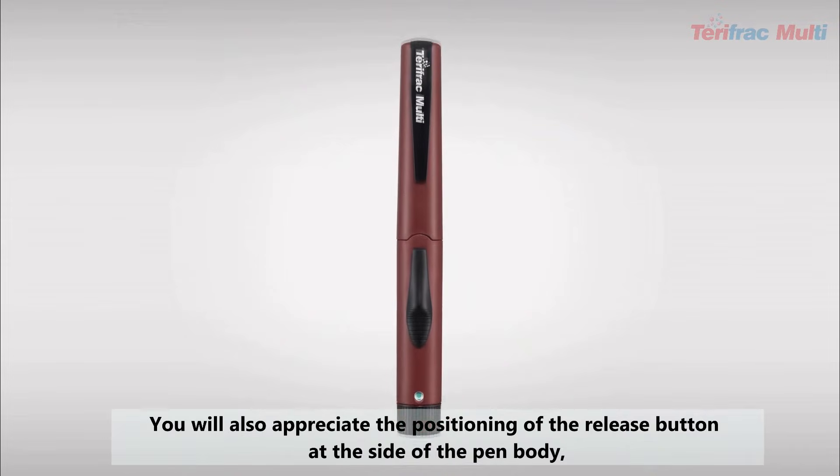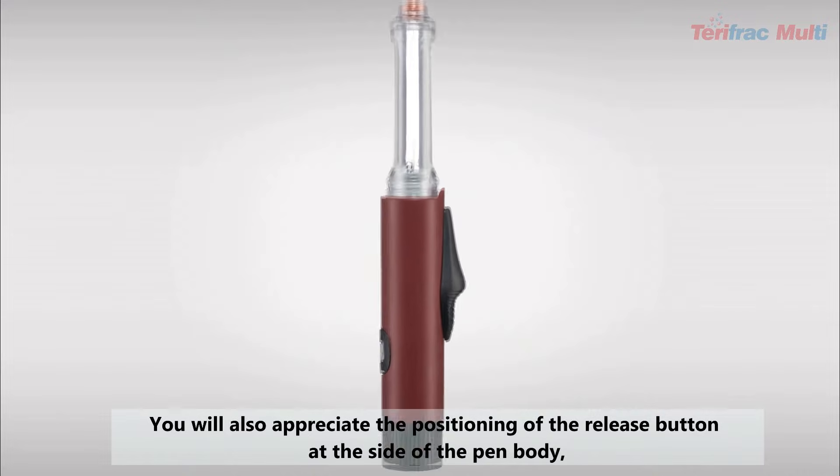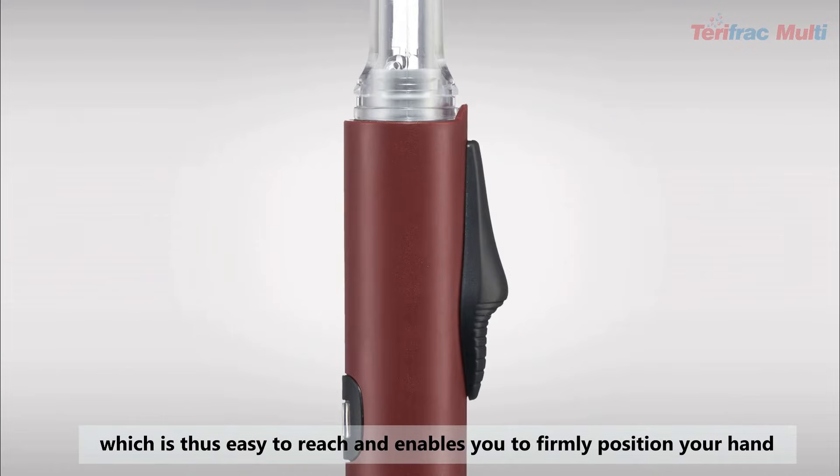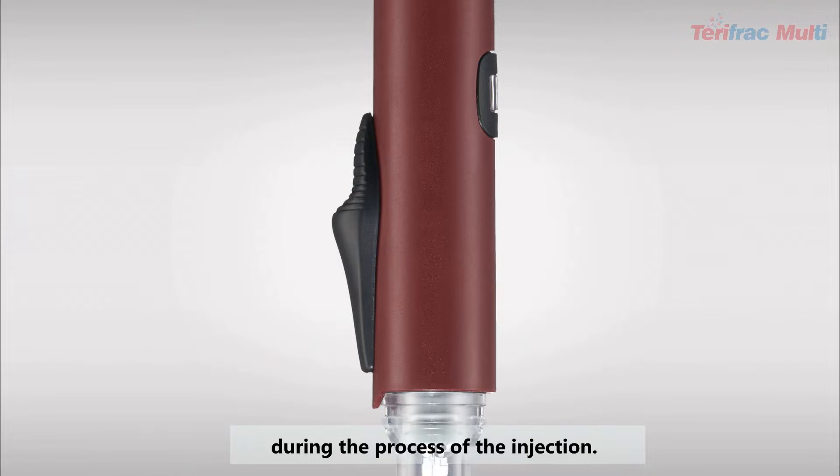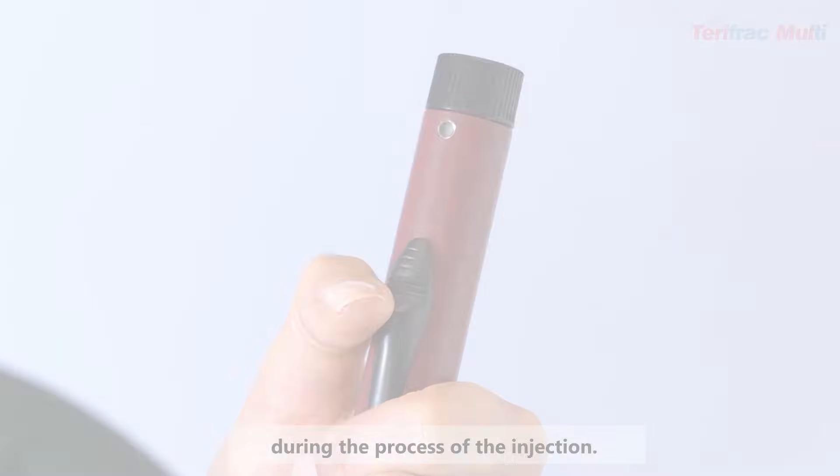You will also appreciate the positioning of the release button at the side of the pen body, which is easy to reach and enables you to firmly position your hand during the process of the injection.